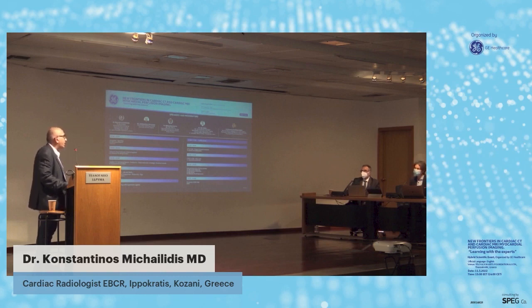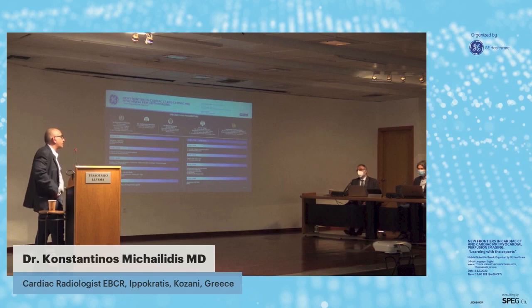So I use it, however we expect a new version of CAD-RADS. We know that there are a lot of drawbacks in CAD-RADS as it is, because it is mostly focused on the stenosis, and we know it's not only the stenosis. Of course, in CAD-RADS we have the modifiers: vulnerable, stent, graft, or non-diagnostic, but I do not think there are enough. I think we need more modifiers like anatomic anomaly, maybe not myocardial bridge, but some coronary anomaly, some other anomalies, or of course more characterization of plaque stability. And we expect the new CAD-RADS to include all these new issues, to address them more, to describe all the information included in the CT coronary angiography.